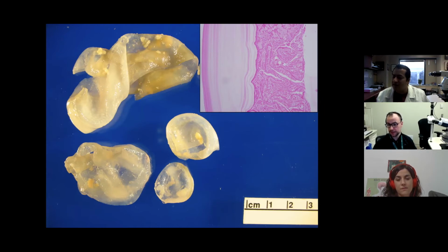And a piece of trivia: did you know that the hooklets are actually AFB positive? Yes. They're brightly positive on an AFB stain. So if you ever see brightly positive things, that can be a trick. Correct. The main utility of that trivia is to torture residents. Yeah, and when the residents are getting all the answers right, that's the one to pull out. You're like, all right, so great job on this one, guys. Let's go to this one.